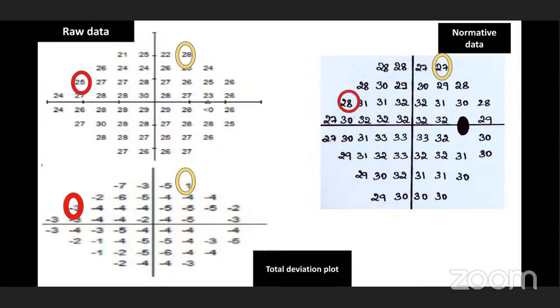If the raw data shows 25 and the deviation plot shows minus 3, and the normative data is 28, the retinal sensitivity is less compared to normative data. In the total deviation numerical plot, we see how much the value is deviated from normative data.